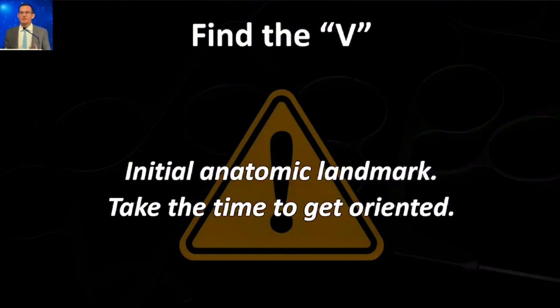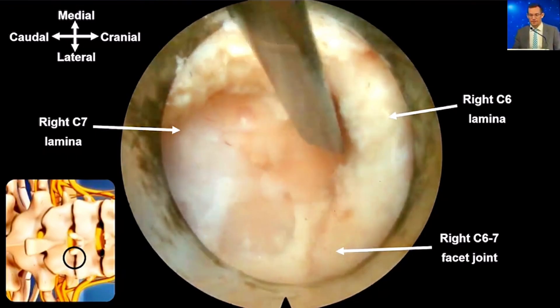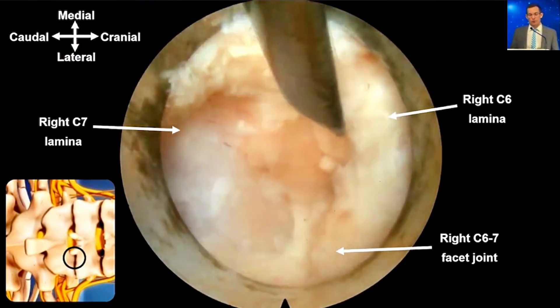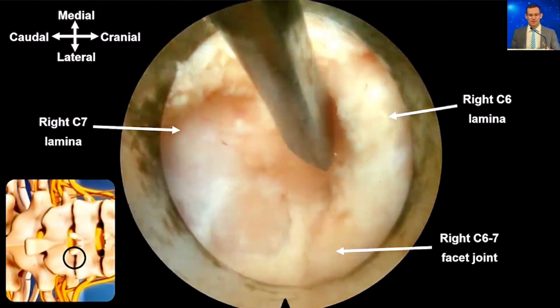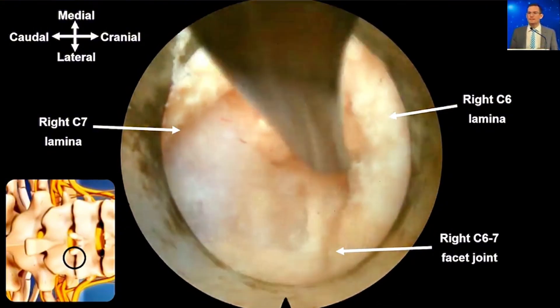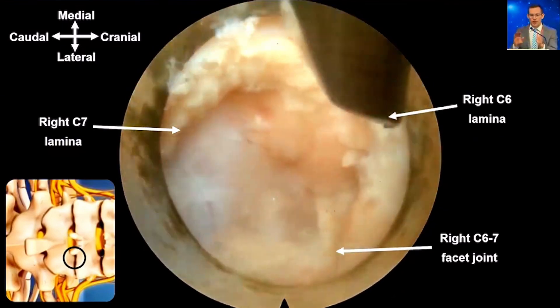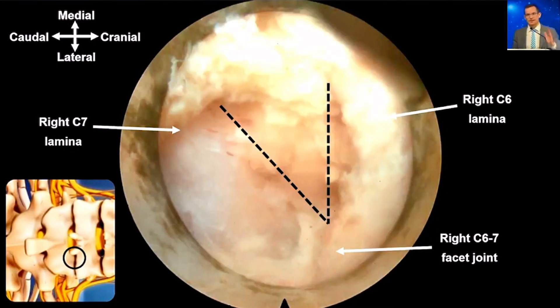The next thing is to find the interlaminar V — some people call it the interlaminar Y. That's your initial anatomic landmark, so take some time to get oriented. At C6-7 on the right side: cranial is to the right of screen, caudal to the left, medial at the top, lateral at the bottom. You can see the C6 lamina on the right, the C7 lamina on the left making that V, with the interlaminar window in between. Once you've identified that, you're much less reliant on fluoroscopy — I don't take any more shots for the rest of the case until my final x-ray proving the extent of decompression.